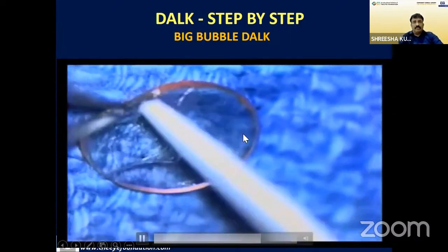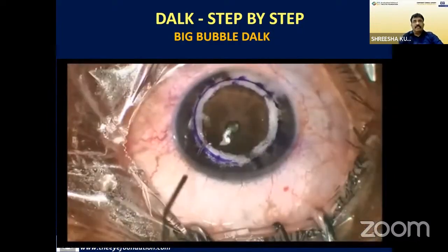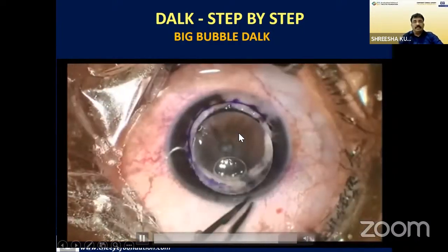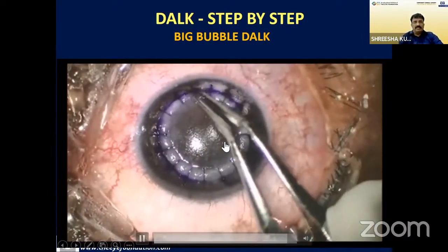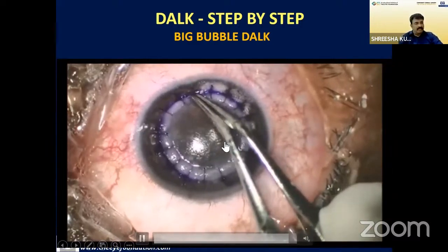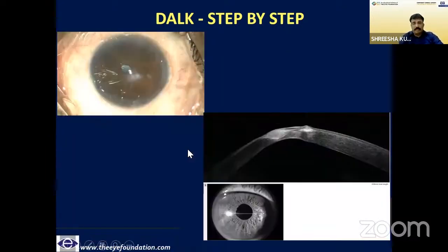And now the donor's preparation. Once this is done, I wash off the surface and place the graft on the host bed and secure it with monofilament nylon.